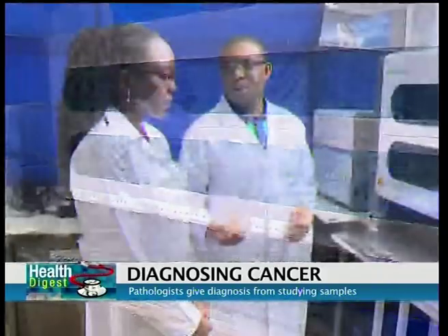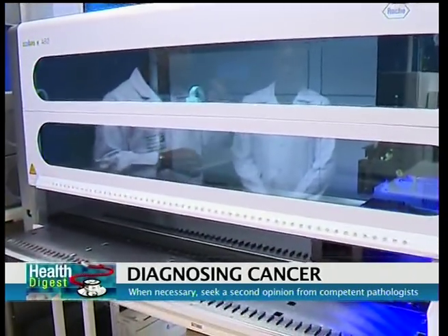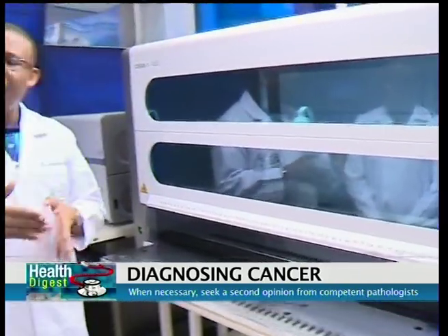In fact, this allows a woman to even take a self-sample. So you don't have to go to the doctor, you can collect the sample, and then we are looking for high-risk HPV virus that is responsible for causing cervical cancer. So with this new technology, we don't need the pathologist to look under the microscope. With the sample, the machine is able to tell us this is high-risk HPV, and when you have high-risk HPV, now we go ahead and do a pap smear or a biopsy. So not everybody needs a pap smear because it can be quite uncomfortable.